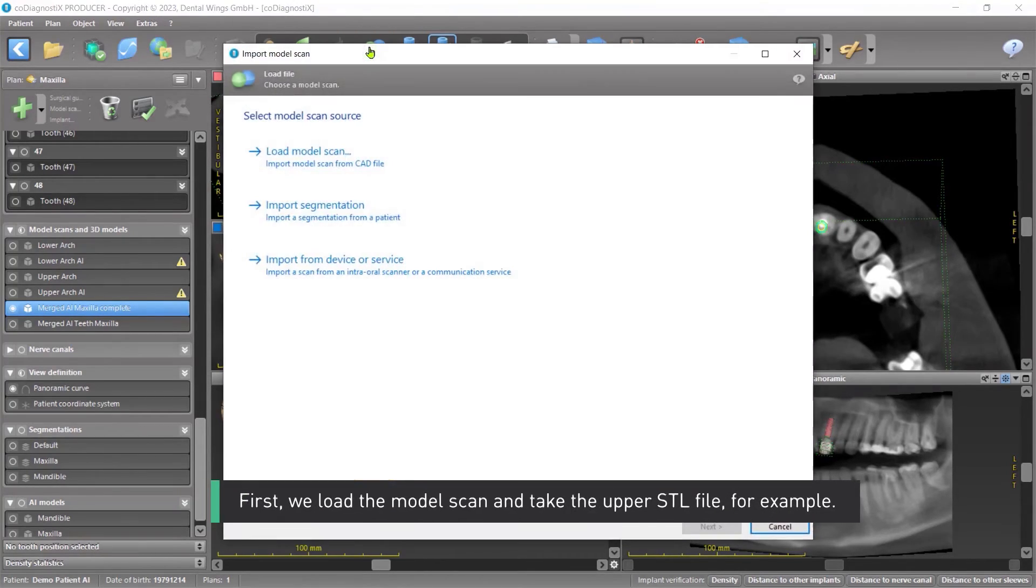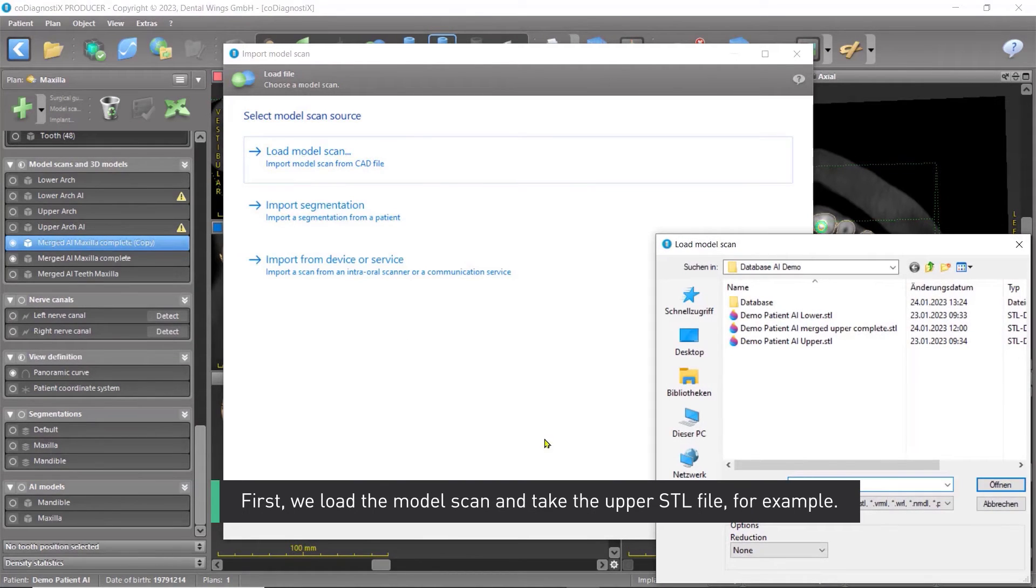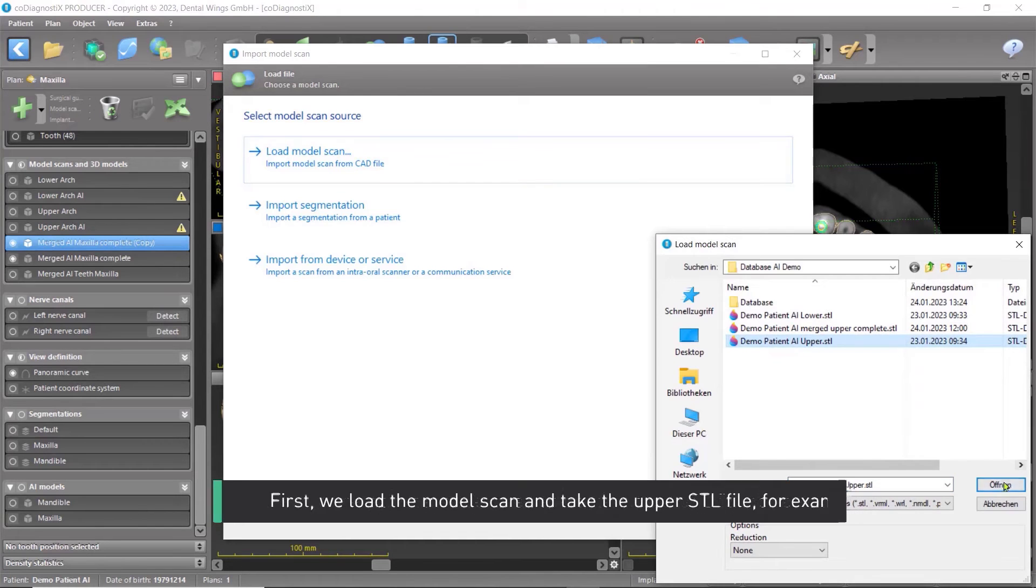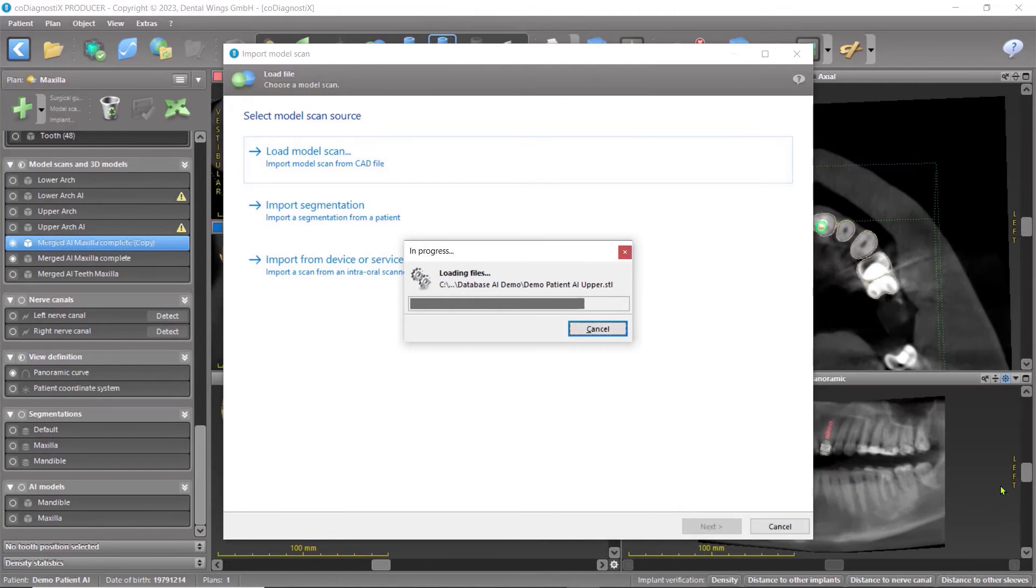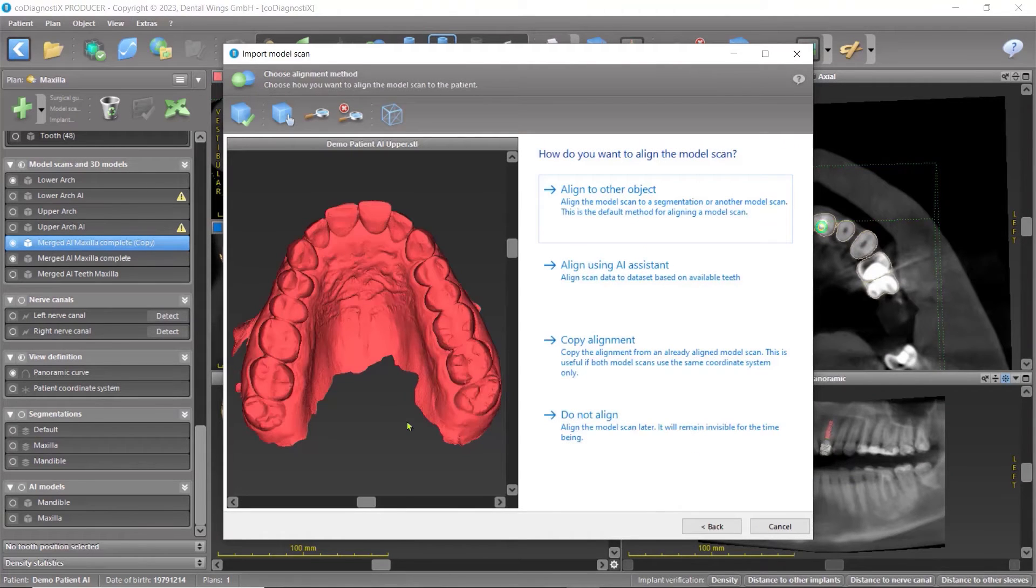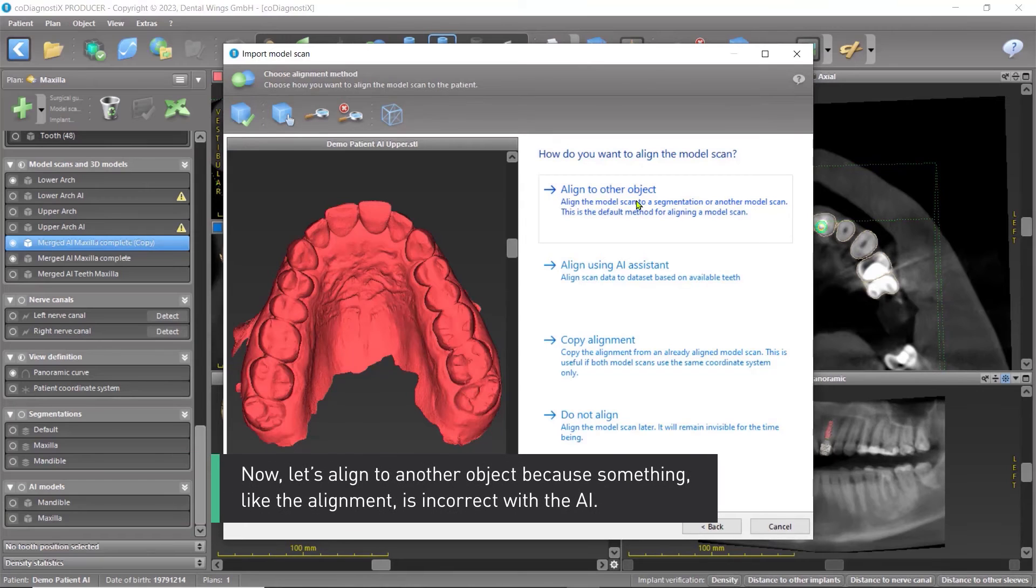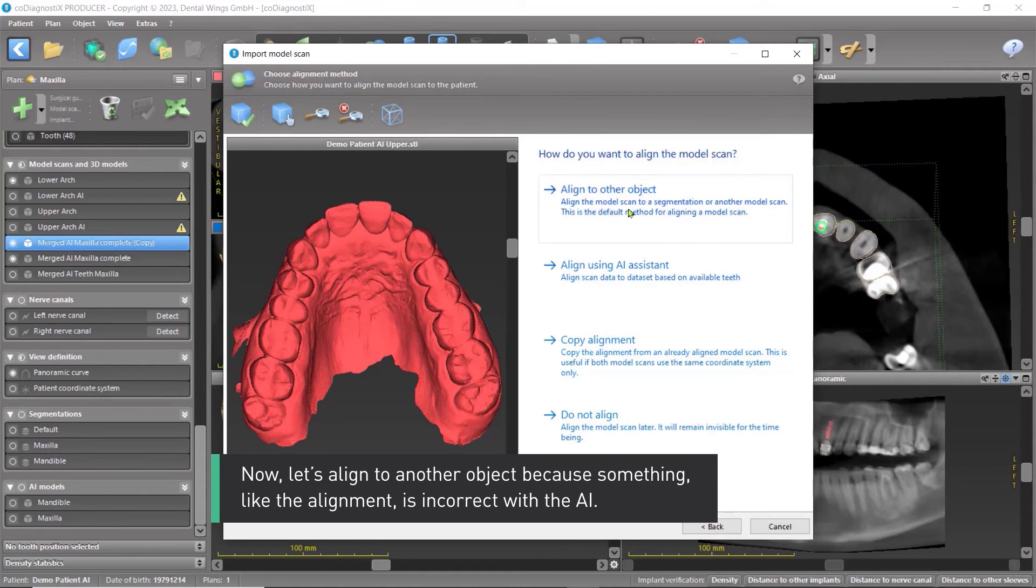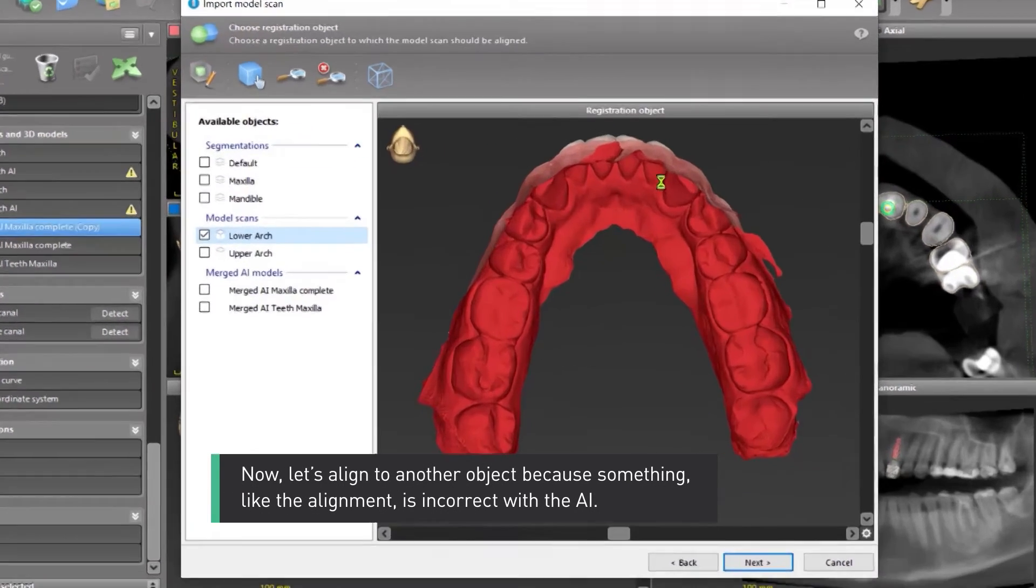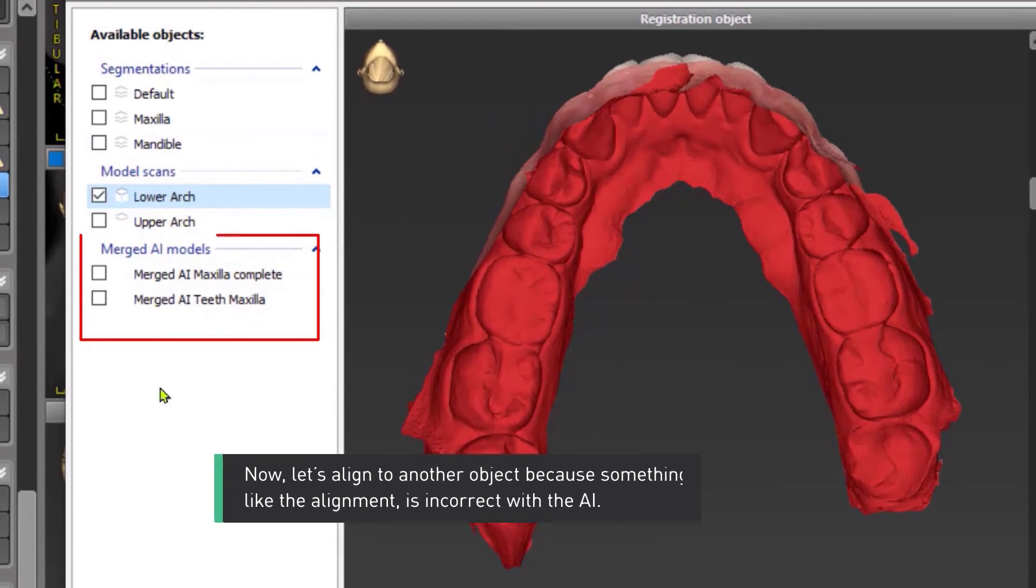First, we load the model scan and take the upper STL file, for example. Now, let's align to another object because something, like the alignment, is incorrect with the AI.